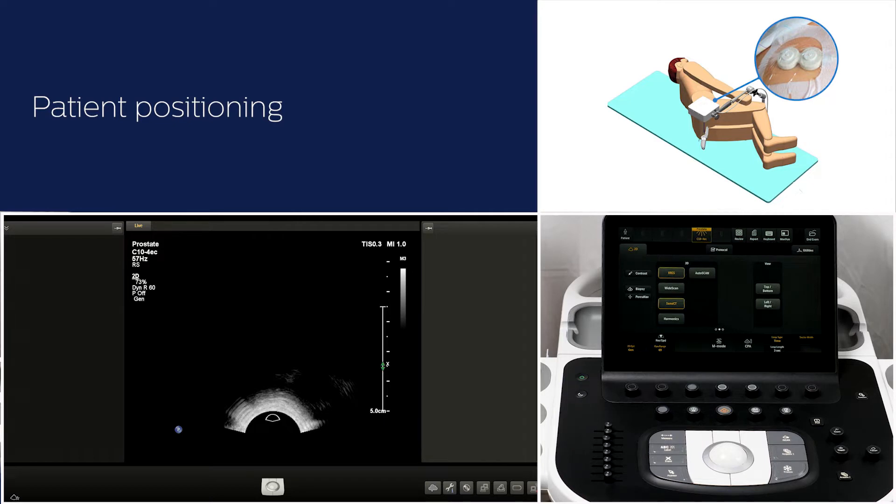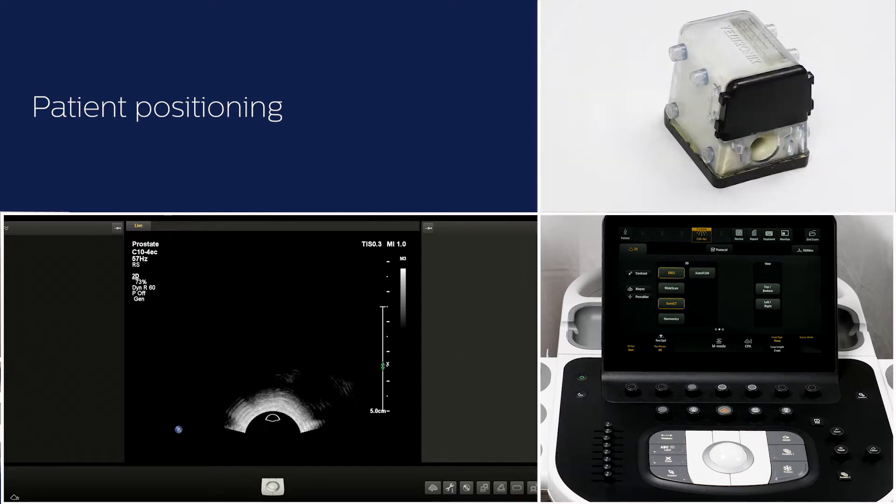Plug in the patient tracker on a stable position like the hip or thigh region. For this demo, I am going to use this prostate phantom and I will place the patient tracker on the phantom.